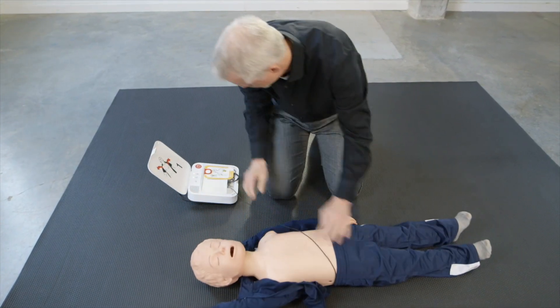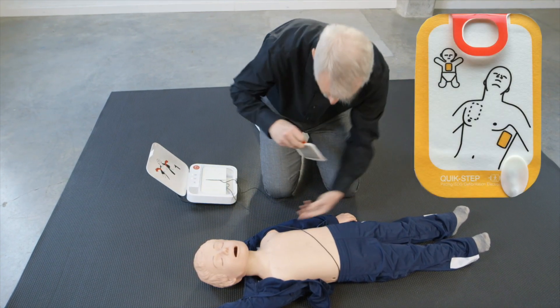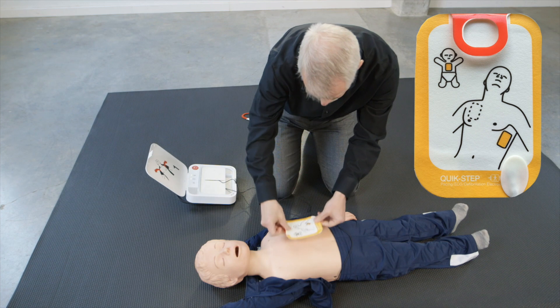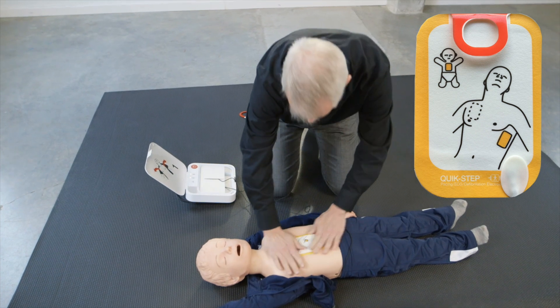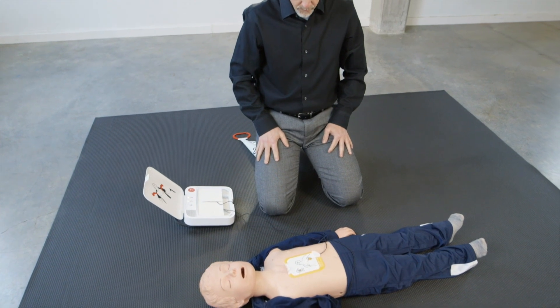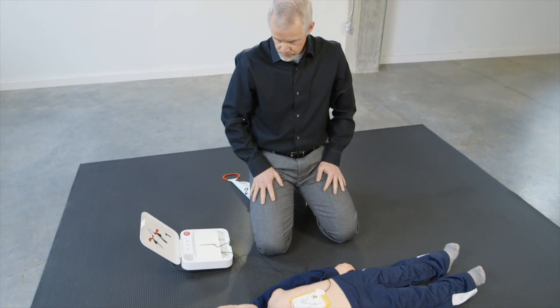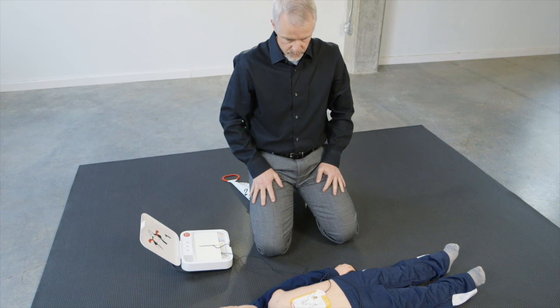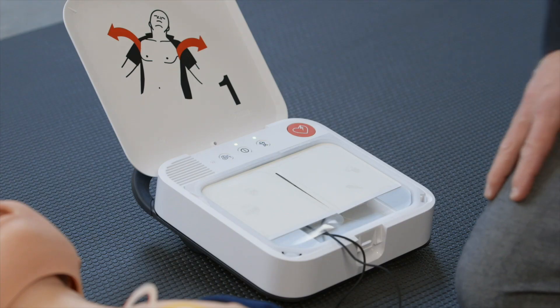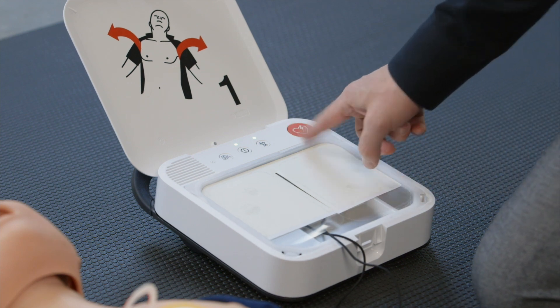Apply pads to bare skin exactly as shown in the pictures. Press pads firmly. Do not touch patient. Analyzing heart rhythm. Everyone clear. Press flashing button.